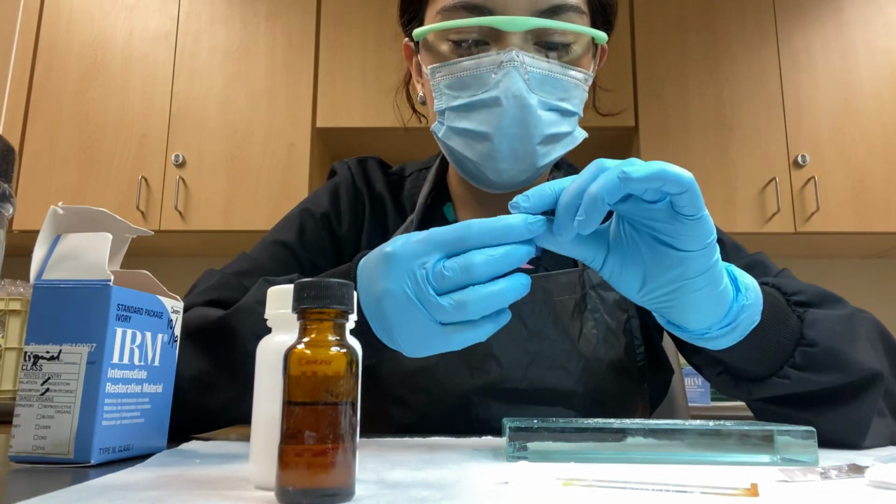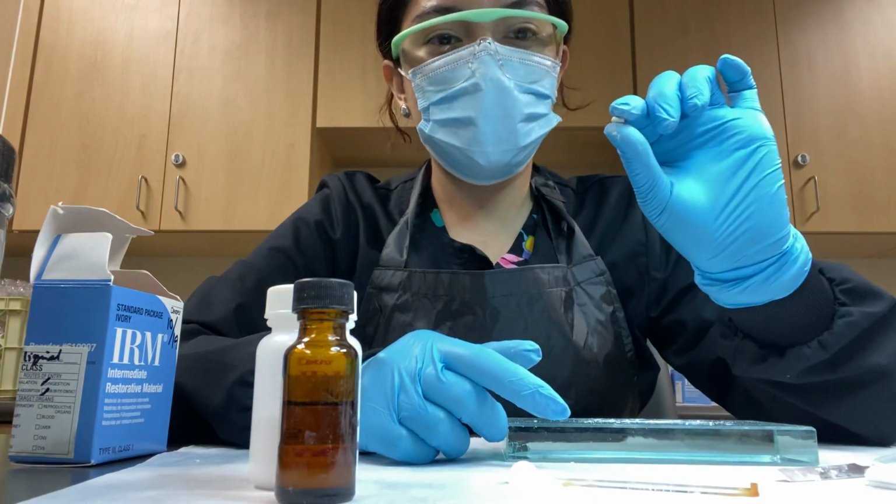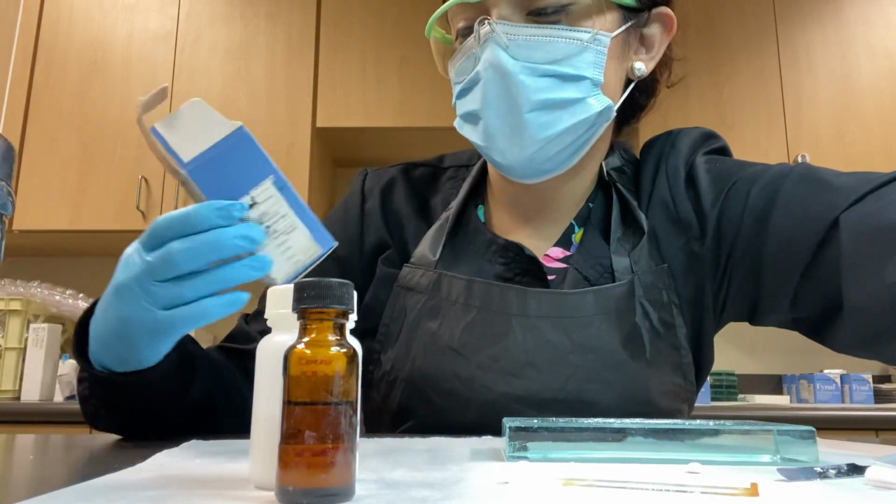And before you use this for the pulp, you use the calcium hydroxide liner, and then you place this on top. And that is mixing IRM.